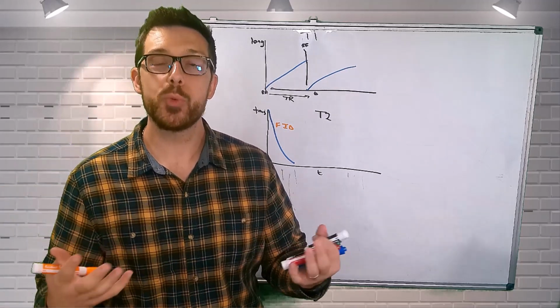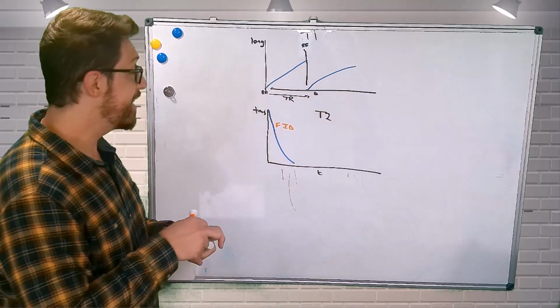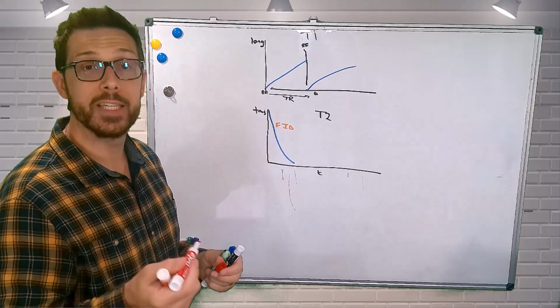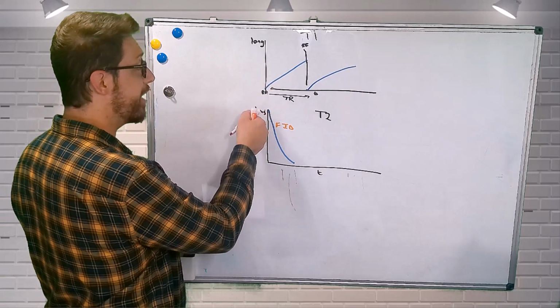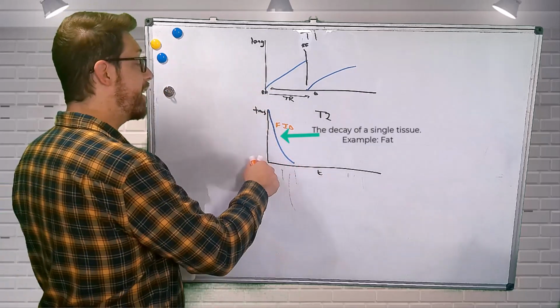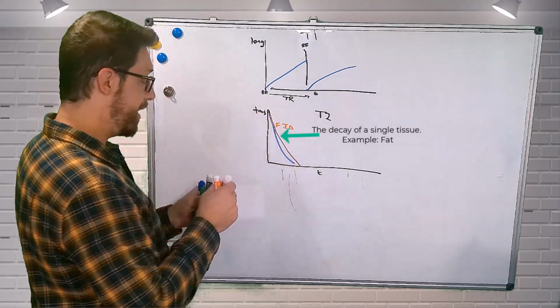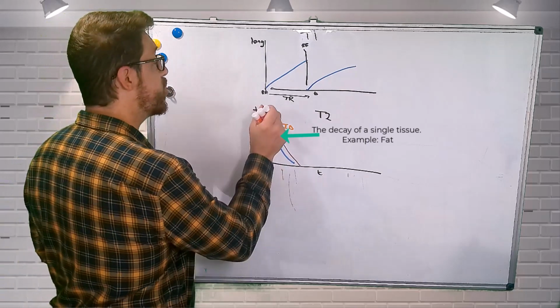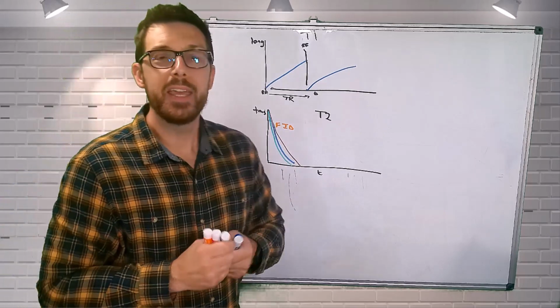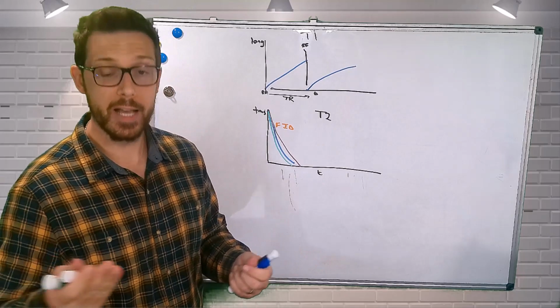And since those two situations vary after every single TR iteration, the free induction decay is going to be different after every single TR. So I excite my patient, I get all this transverse magnetization, I get free induction decay. I go back and excite my patient again, I get free induction decay. I excite my patient again, get this transverse magnetization, I get this decay. Now, if this happens after every TR, we know TE controls T2 contrast.